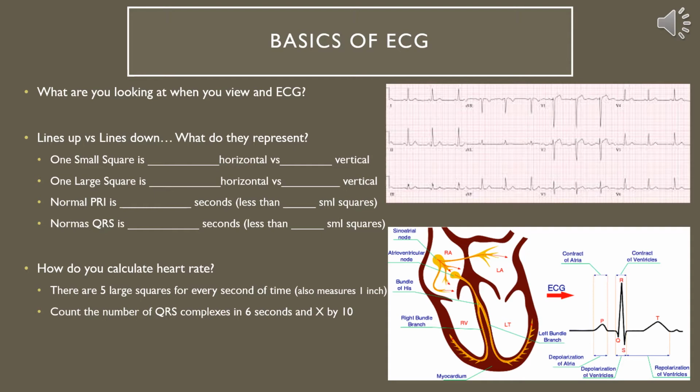In an ambulatory setting, EKG is generally your best tool for evaluating cardiac arrhythmias other than your physical exam. Unlike an inpatient or an emergency department setting where you can have continuous lead monitoring for an extended period of time, when you do an EKG, it's just a snapshot. And so you are really limited to the findings at that time of evaluation, or the findings that have prolonged effects on that EKG strip. Sometimes you will see some wave abnormalities several hours status post MI, and you can see that on your EKG.